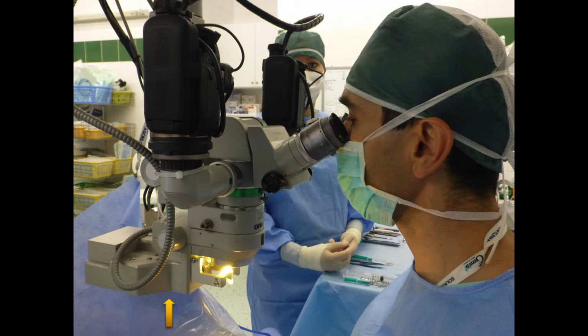We do have several microscopes. I also have Lumera, but this ancient microscope is actually my favorite one, and I do most of the surgeries here. The optic is huge. The reflex is from any angle, and I think this is the best microscope I ever had. Also, the service cost is very low. It runs and runs and runs, so I like it. Even the 3D 4K cameras which are on the microscope are bigger than the laser, so that just tells us about the size of this laser system.